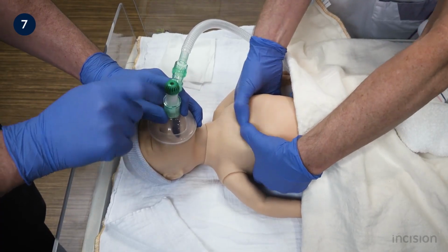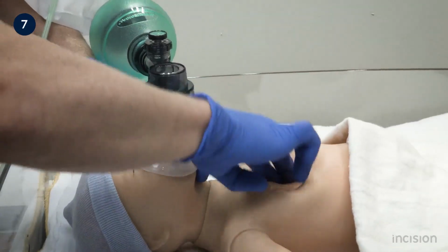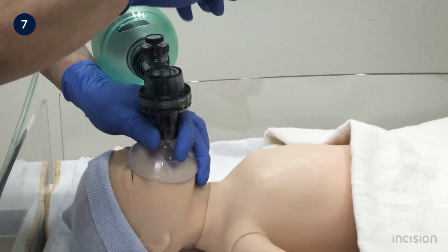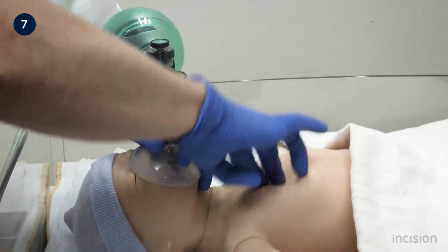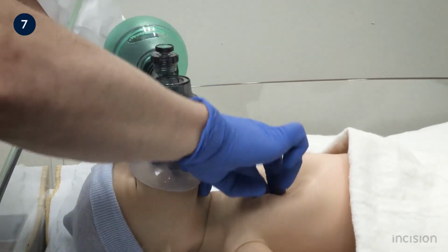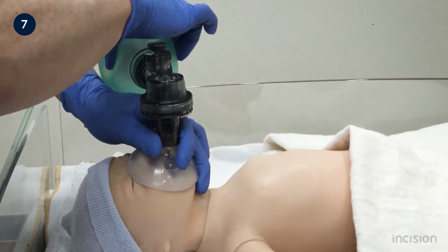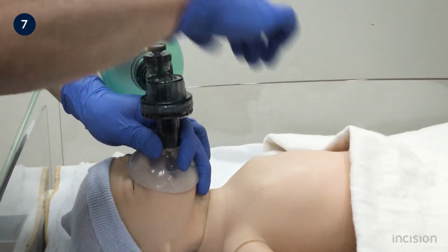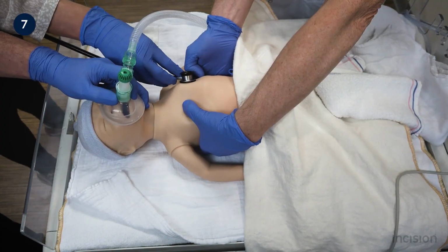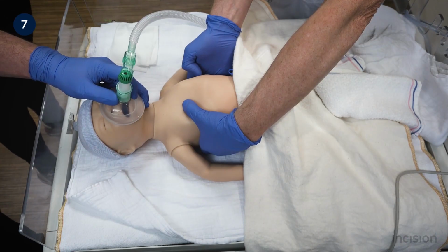Note that in an outreach or home birth situation, the healthcare professional may be on their own. When this is the case, chest compressions are given with the index and middle finger of the same hand providing the ventilations. Note how the self-inflating bag is resting on the hand that is holding the breathing mask with the CE clamp technique. After 30 seconds of chest compressions and ventilations, the condition of the neonate is assessed in order to determine the next step.